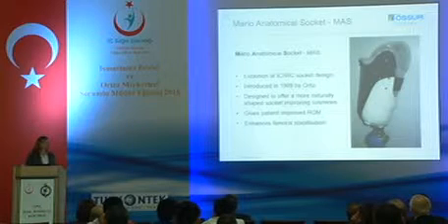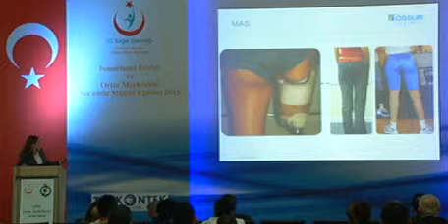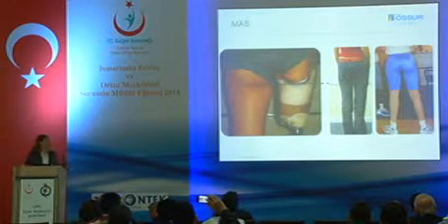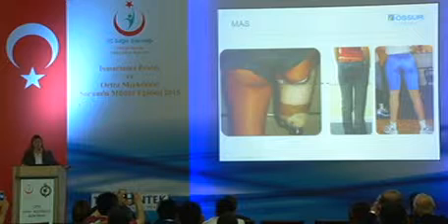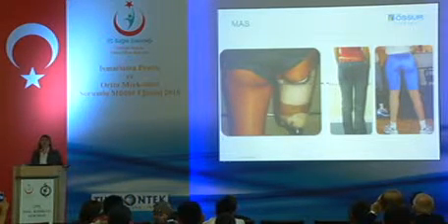It also maintained the femur in a more adducted position or in the more anatomical position, giving them much more stability. So here you can see that it looks like there's a lot of lateral shift onto it, but it's because there's more adduction into the socket.